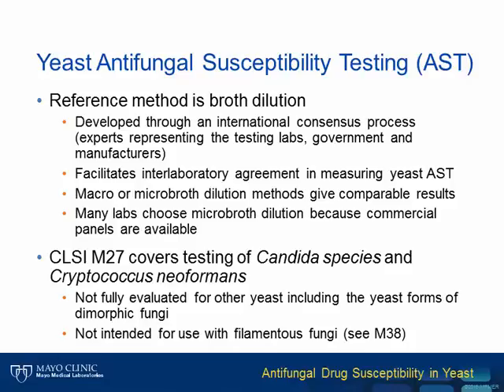As I mentioned, the reference method is broth dilution, but either macrobroth or microbroth dilution can be performed, and equivalent results can be achieved regardless of which format is performed. The CLSI M27 document is intended to provide methodology for testing of yeast such as Candida species and Cryptococcus neoformans, but it is not intended for use with the yeast forms of the endemic dimorphic pathogens such as Histoplasma capsulatum or Blastomyces dermatitidis. The method is also not intended for use with filamentous molds such as Aspergillus species, and there's a separate CLSI standard for mold susceptibility testing, which is M38.